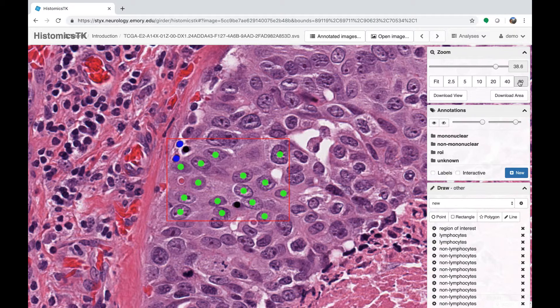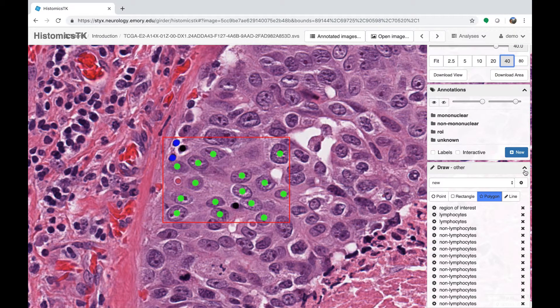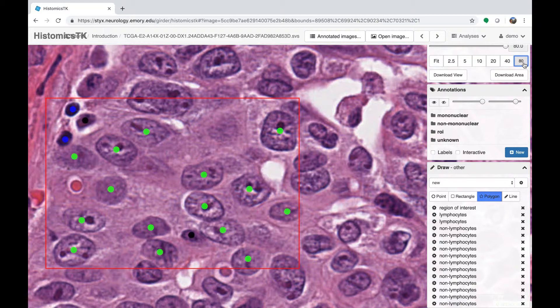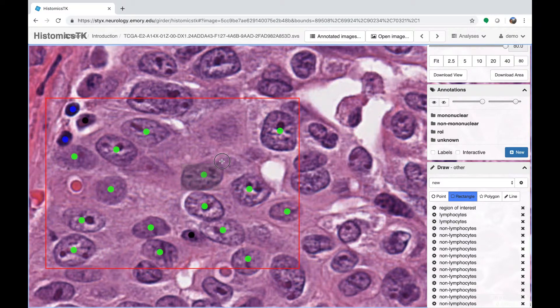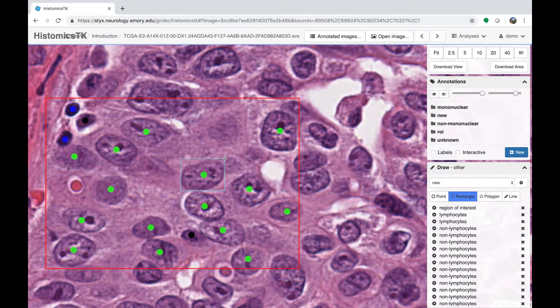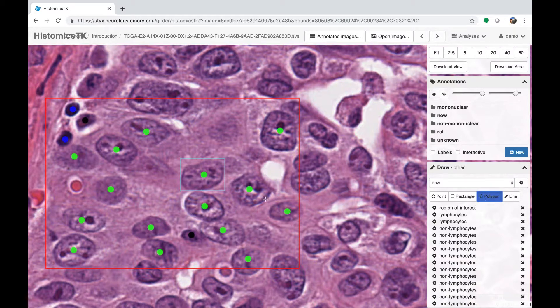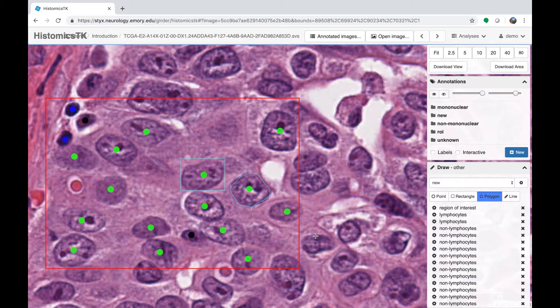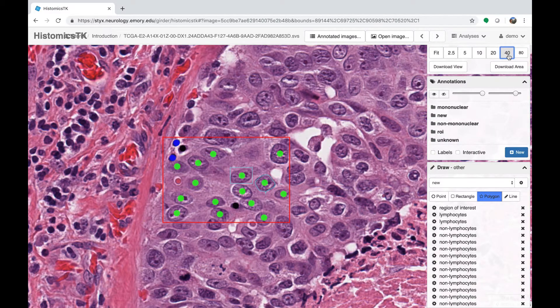Use the digital zoom to zoom in on a region, then place a rectangle as a bounding box around one of the nuclei by selecting the new style and the rectangle tool and dragging the bounding box across the nucleus. There's also a polygon tool to trace objects: click to start the polygon, release the mouse, trace around the boundary, and right-click to complete the polygon as you approach the starting point. The shading indicates which region is the interior, helping you trace complex objects.